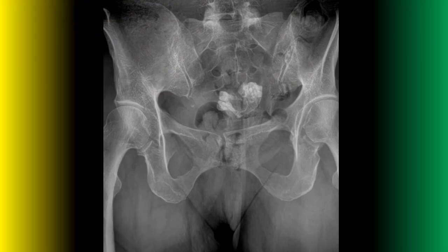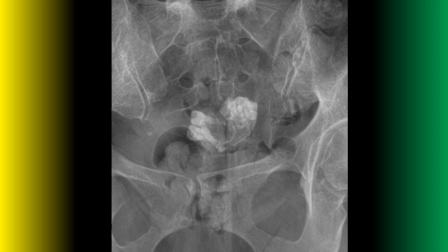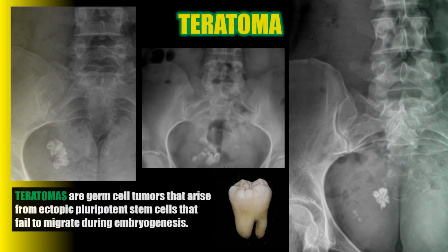On this pelvic radiograph there appears to be a mass-like soft tissue calcification within the pelvic basin — your first thought should be a fibroid or leiomyoma. However, when we zoom in, this lesion almost looks like teeth, and that's because this represents a teratoma. Teratomas are germ cell tumors arising from ectopic pluripotent stem cells that fail to migrate during embryogenesis — yes, these are teeth growing in the wrong location.